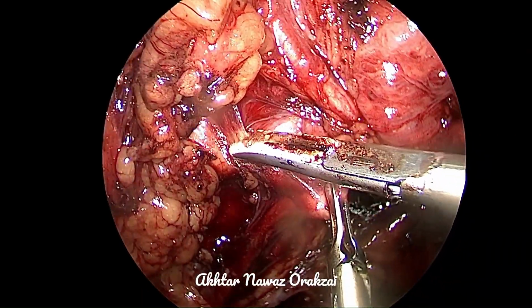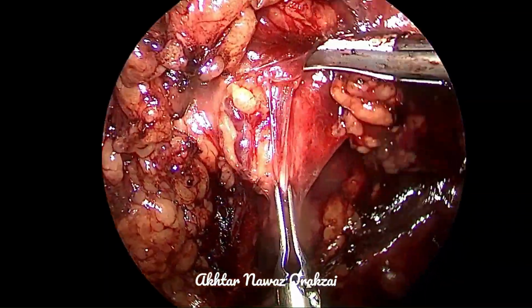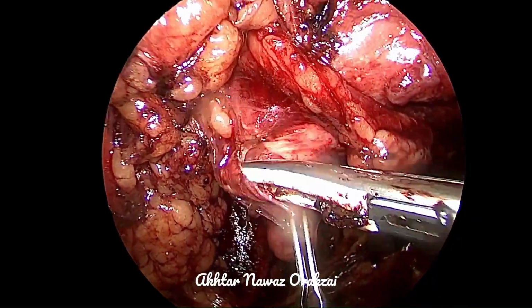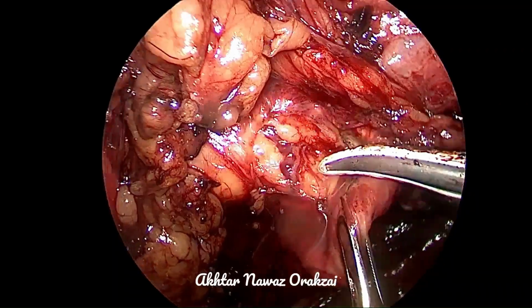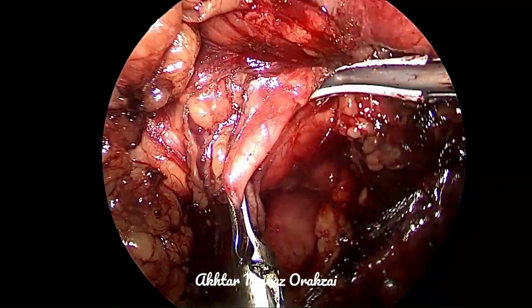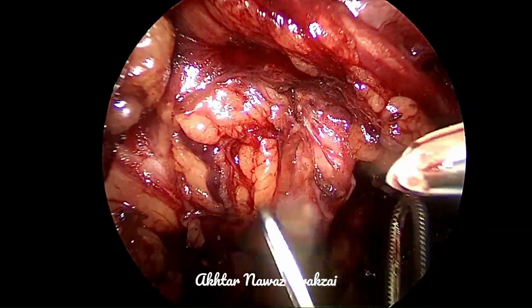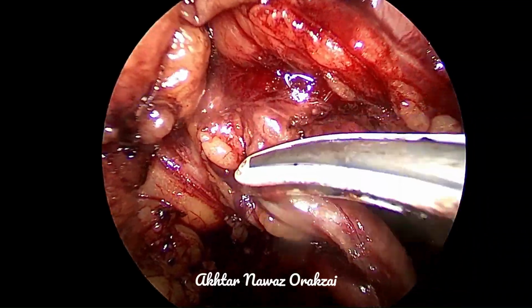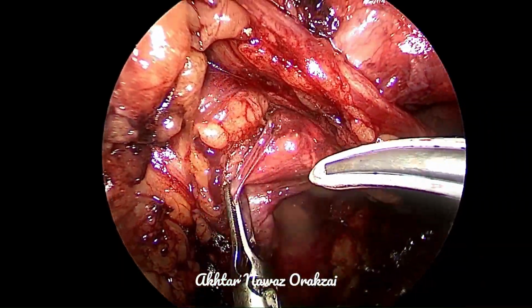It is such a delicate maneuver that one should not denude the ureter. The periureteral sheath must remain over the ureter because, as mentioned earlier, there are longitudinal vessels along the ureter. So the periureteral sheath needs to be preserved. The ureter must not be denuded, and at the same time the tissue needs to be dissected away from the ureter rather than from the vessels. Any injury to the ureter can be compensated for by repairing it or by excising it.